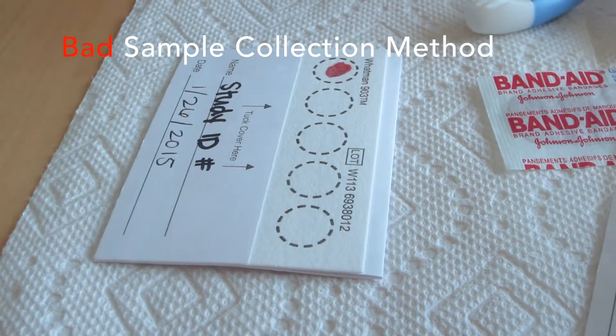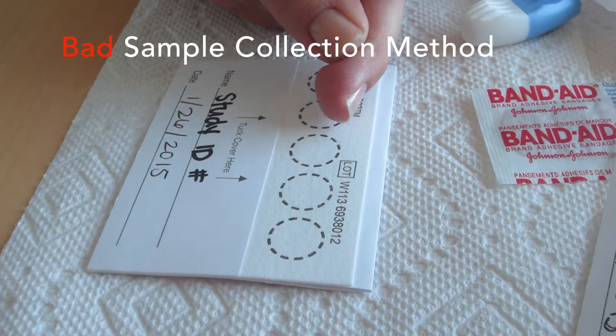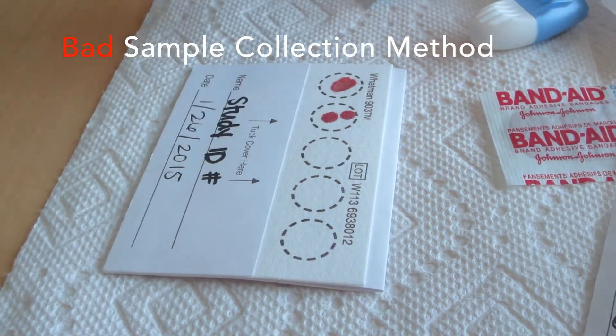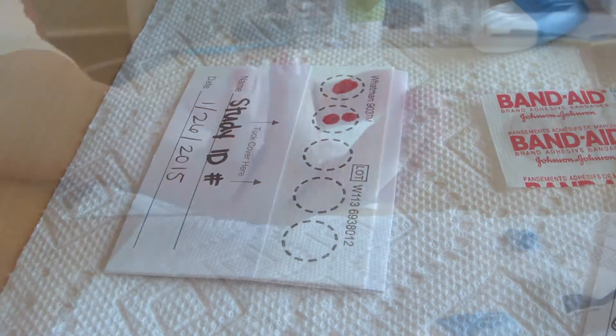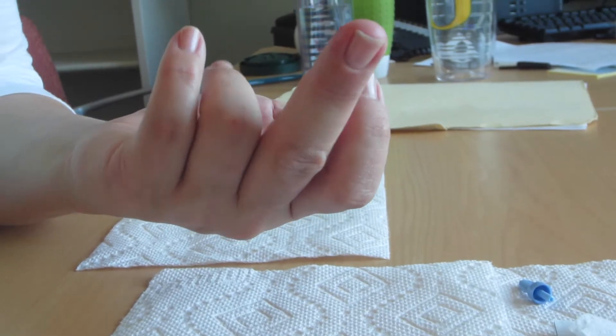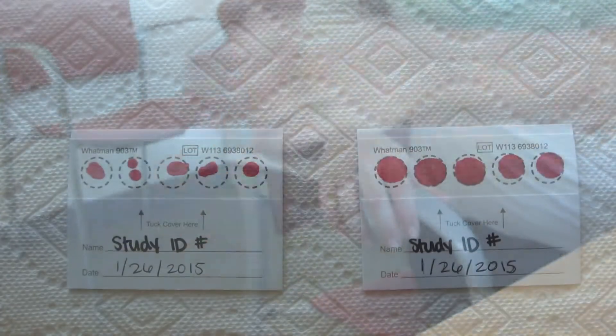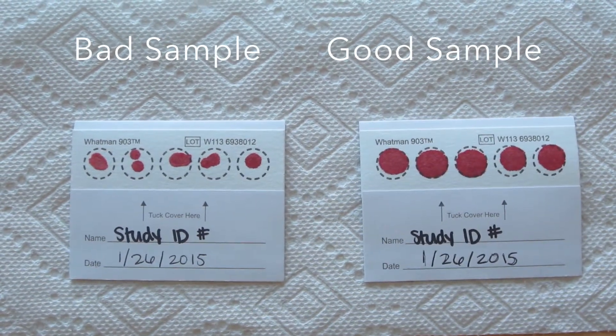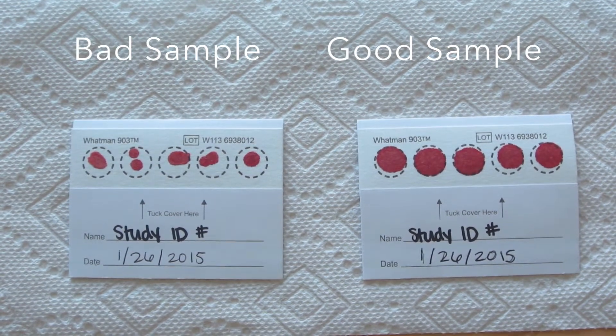Do not press your finger down on the circle or add more than one blood drop to each circle. If blood stops flowing from the pricked finger, you can wipe the pricked finger with gauze or lower your hand below your waist and shake it to encourage blood flow. If none of this works, please use the second lancet to prick a different finger and complete the collection card.